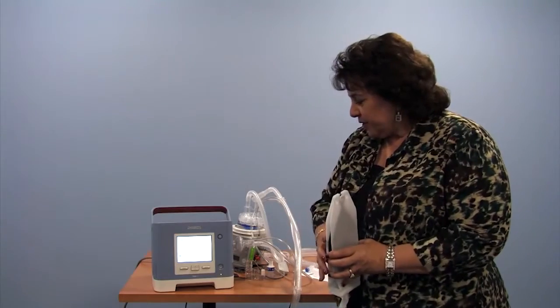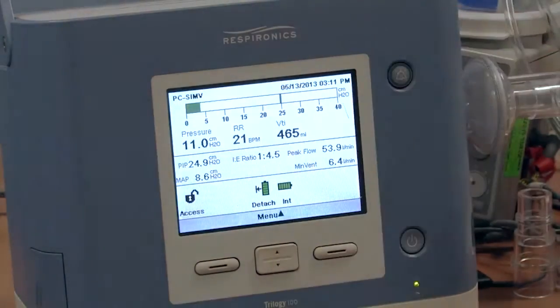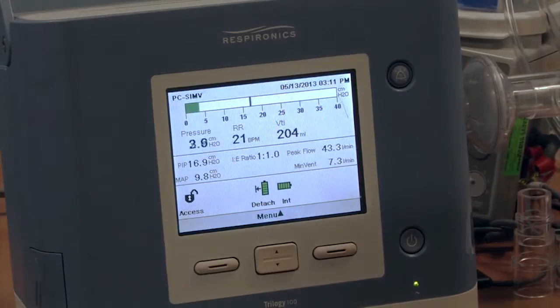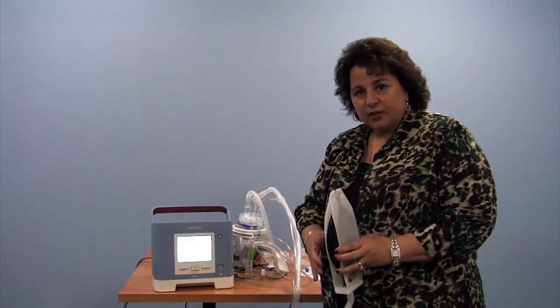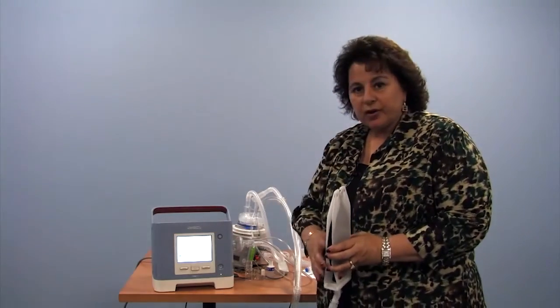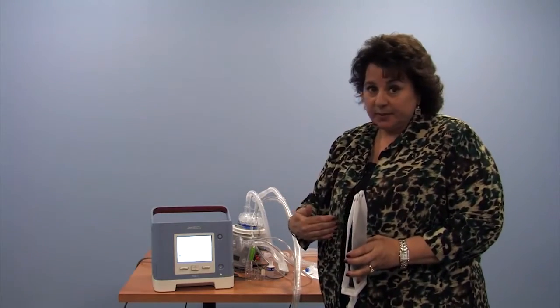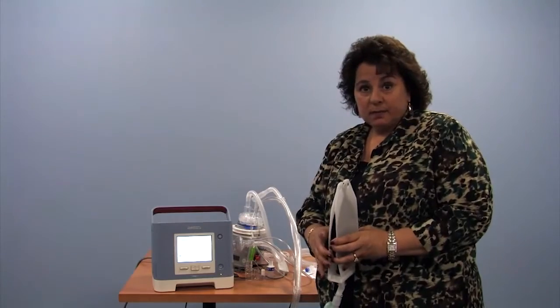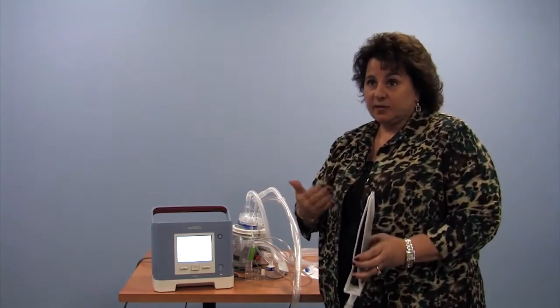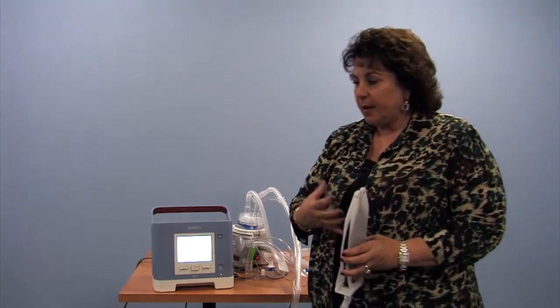Another thing that we see on the face of the machine is this little black dot. See the little black dot? That means that the patient or your child triggered that last breath to turn on. So that is a trigger light and shows us. So during sleep, deep sleep in particular, it's possible that that light will not shine up if the patient doesn't take that last breath on their own and trigger it with their inspiratory force and muscles.